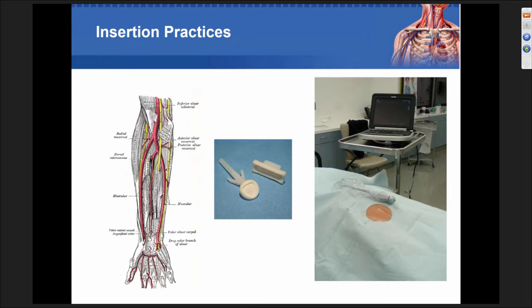We really should be using ultrasound in this state and age. From an infection reduction opportunity, we use chlorhexidine and we prep the area, and we use sterile drapes to make sure that the integrity of the prepping, the insertion, and the inserter are all maintained. We do use an arterial bundle, and we also use an arterial checklist. This is a very, very important line, and these lines dwell within our ICU patient population, and anything that we can do to reduce risk and increase performance of these devices is really optimal.